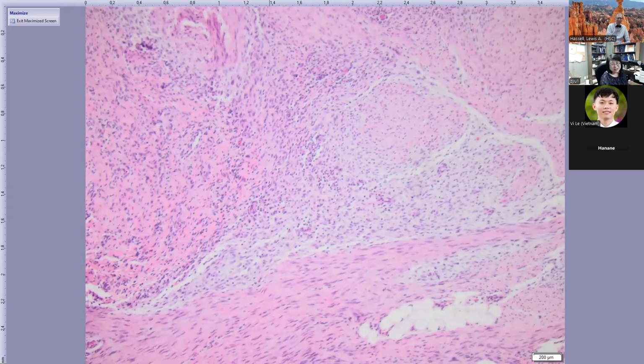It's fibrous, and because of the organoid arrangement we call it hamartomatous; it usually happens in infants. So we call it fibrous hamartoma of infancy. This is a benign lesion. The reason I like to show it is so you do not mistake it for a malignant tumor because of the small cell area.